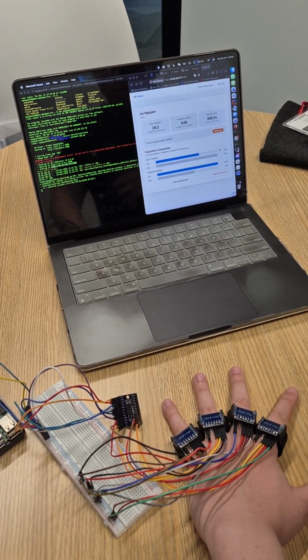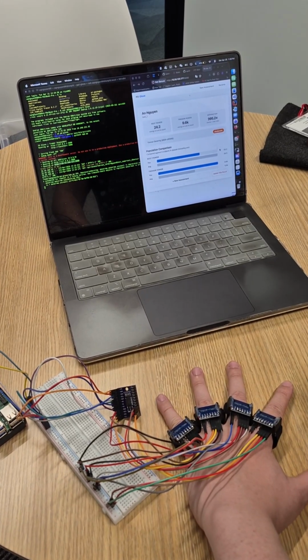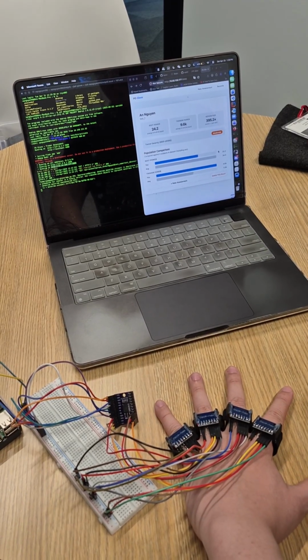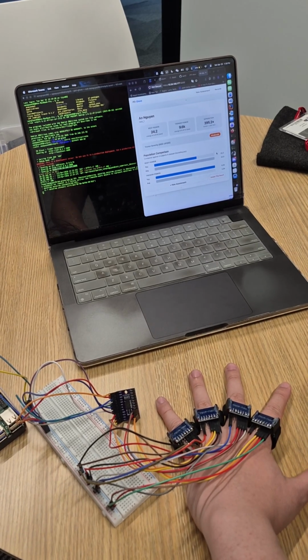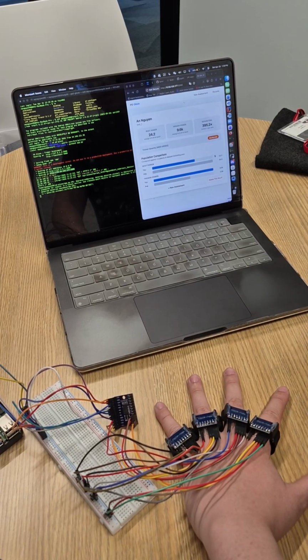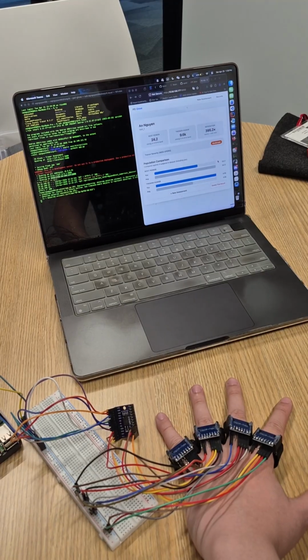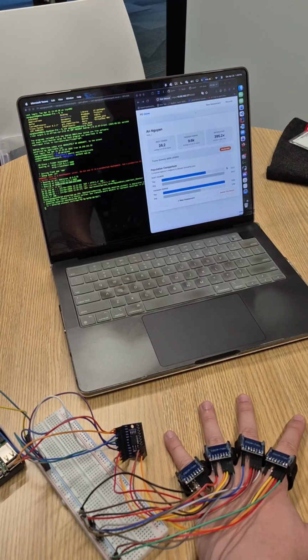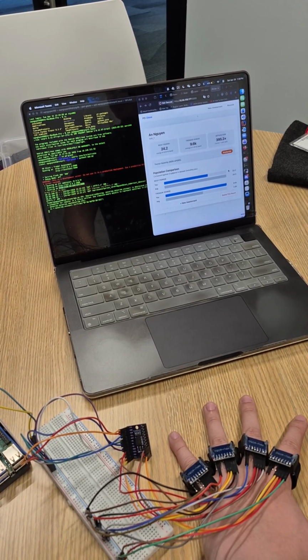And so essentially you can see you have this framework where you have this monitoring system that can be used at home, anyone's home. And it will periodically, like weekly or bi-weekly, as the doctor orders, track the patient's tremor level and then send it all to a cloud application that the doctor can monitor. And so when the doctor sees something irregular, maybe not once, but a trend starts showing, they can just call them in for a patient visit and do any type of checkup as necessary. And so that would save a lot of time and money for both parties. And that's it.